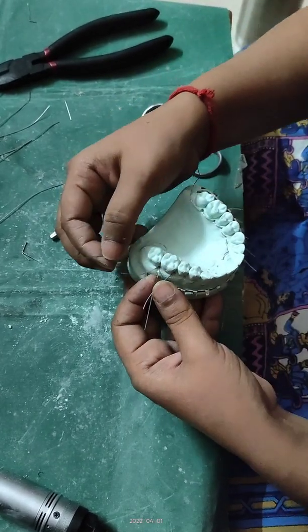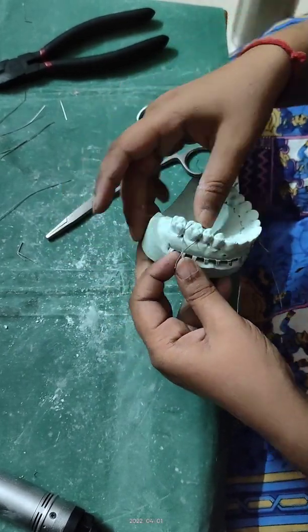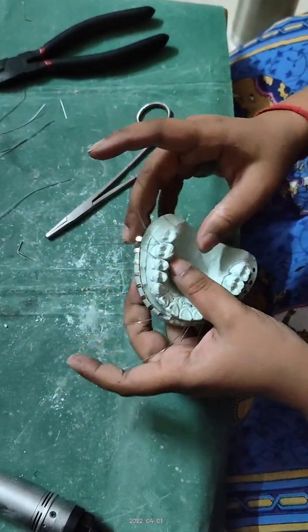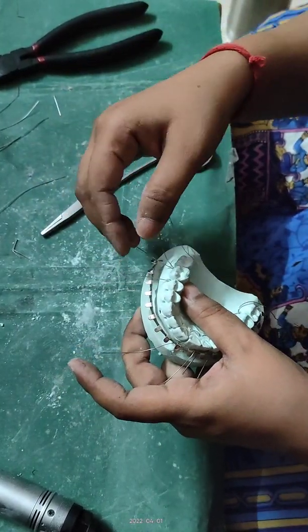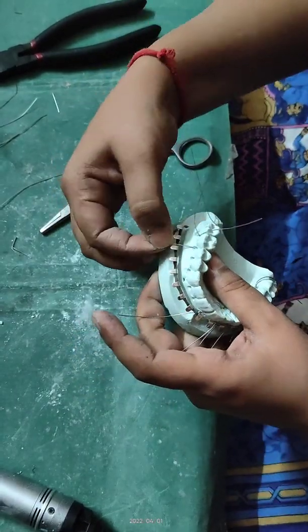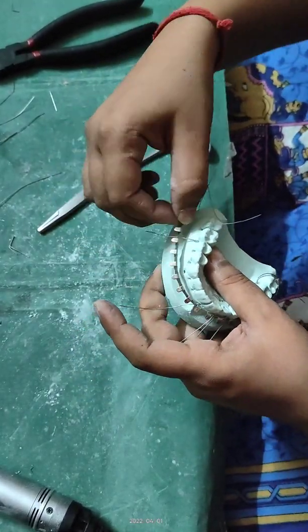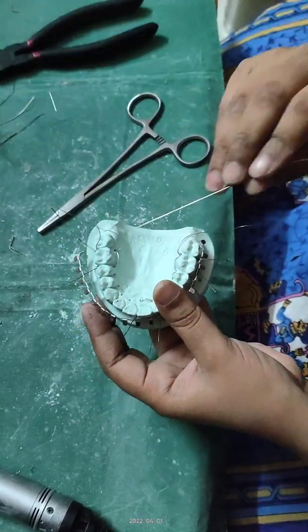You can place it last. For the second molar, the same rule applies: the distal is always on the buccal side and the mesial is always on the lingual side. Put all the wires in place.